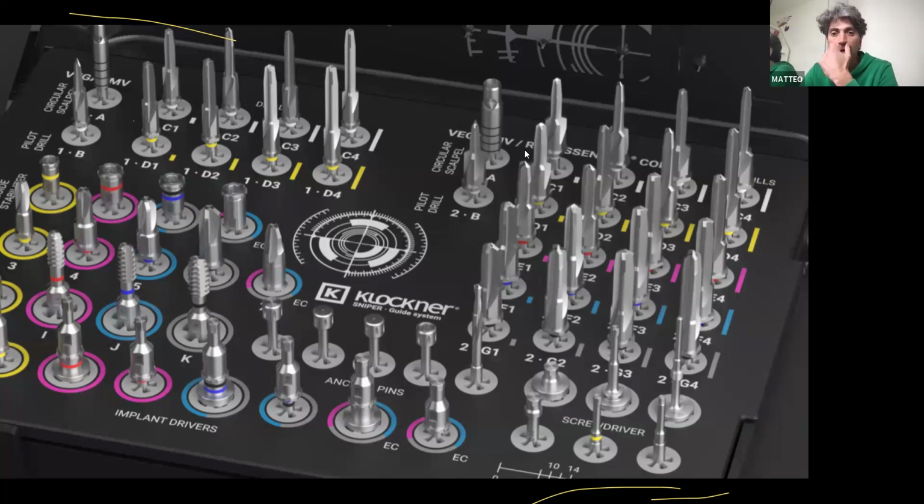Okay. And for other implants, we have all the sequence here.